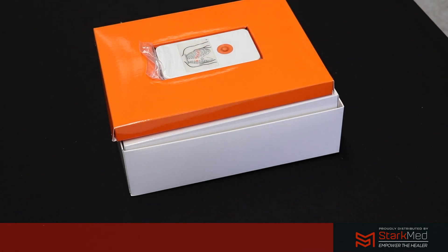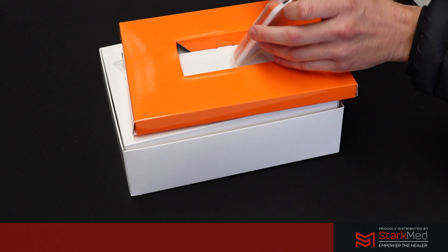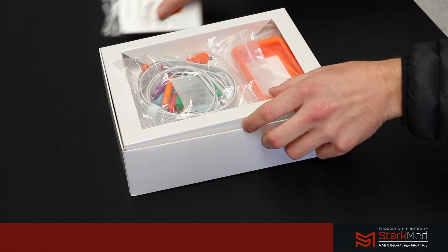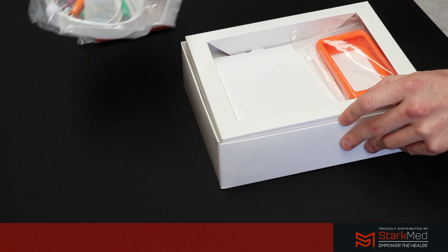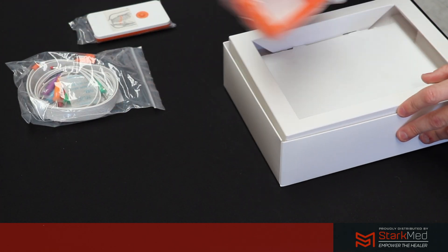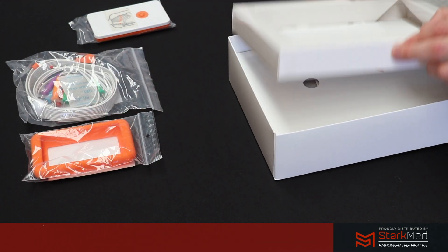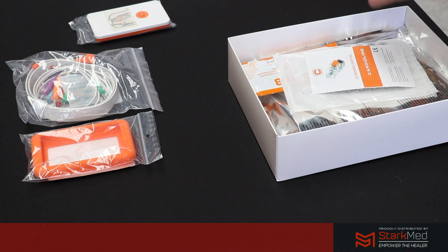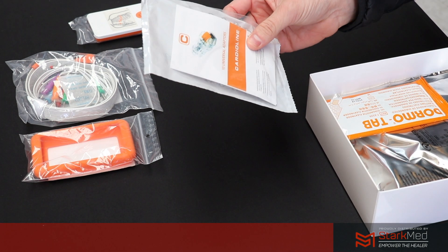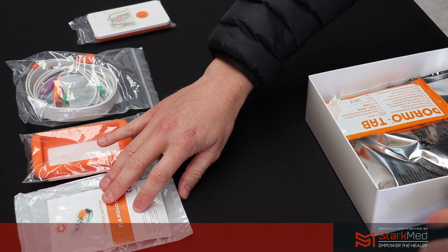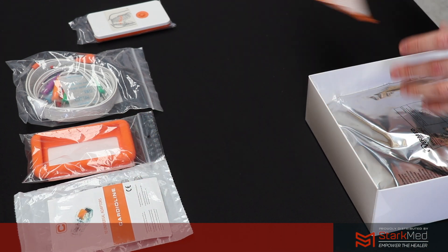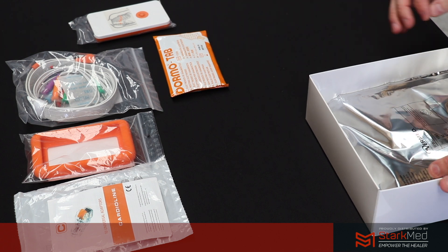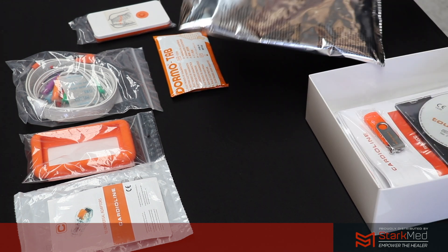Underneath you'll notice your patient cables and your silicon protective case. You'll receive a set of alligator clips, a packet of dormo tabs, and another packet of banana pin electrodes.